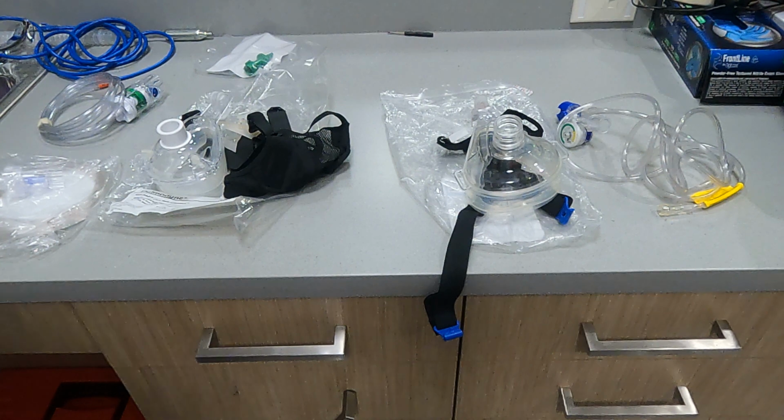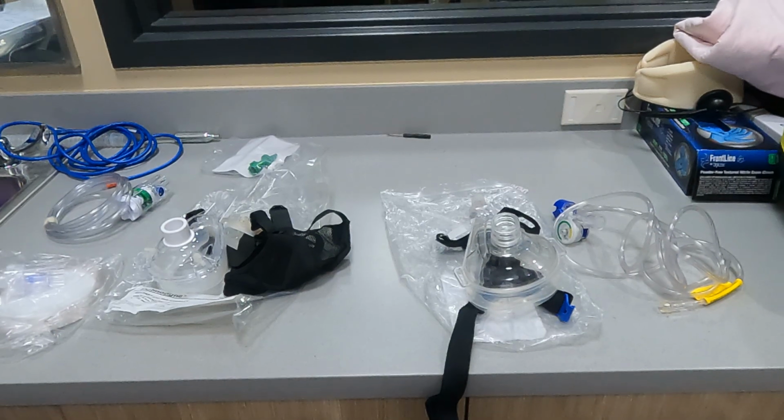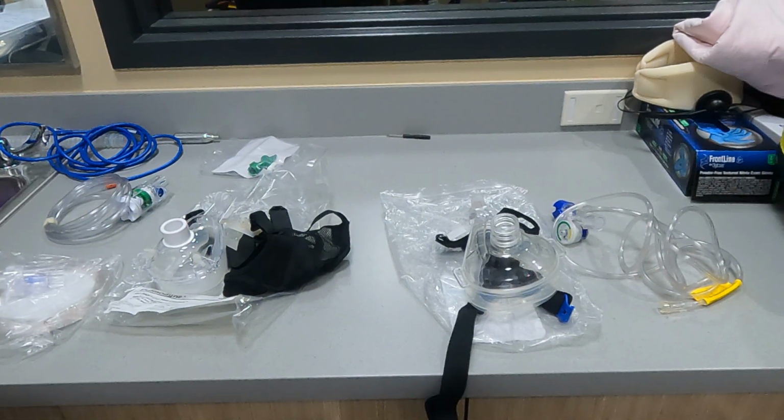So like I said, CPAP is a great tool for your asthma, COPD, and CHF patients. Maybe you've been on scene for a bit, you're trying a non-rebreather, you've tried meds, and they're just not getting any better. But you can also use this, you just walk in and look at your patient and go, ooh, they look like they're having a really hard time breathing. You can go right to CPAP to try and improve them.